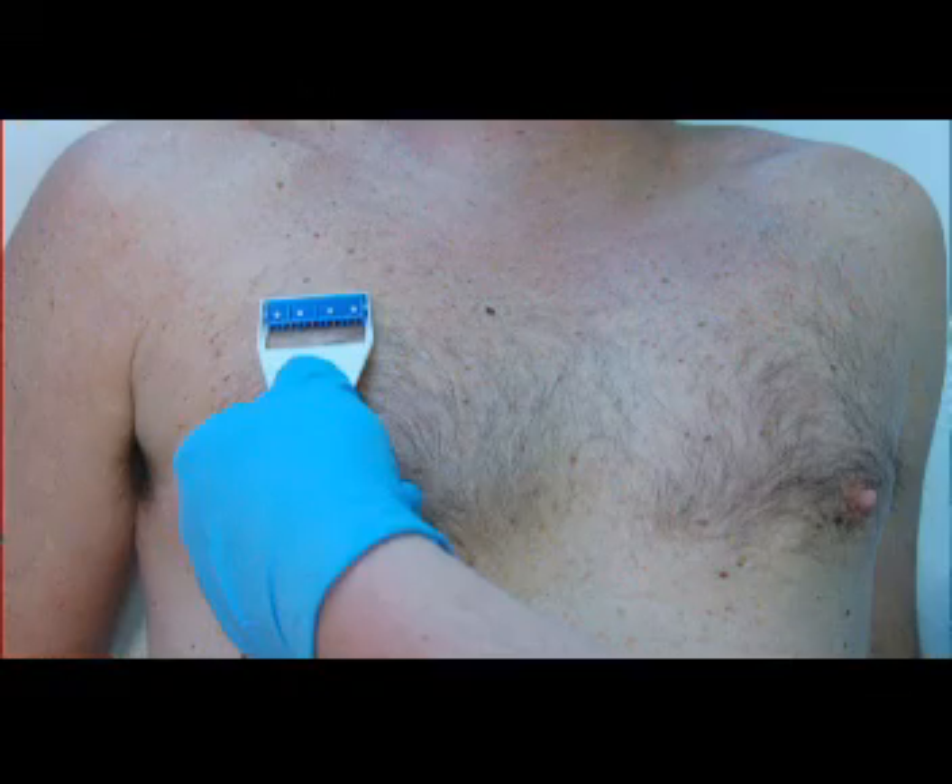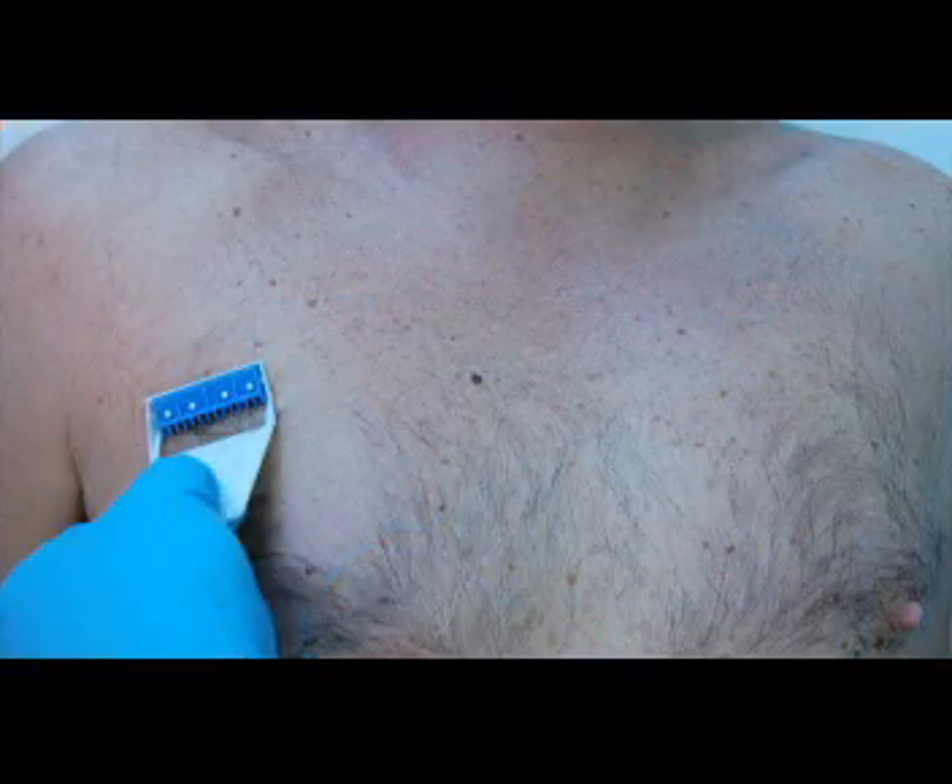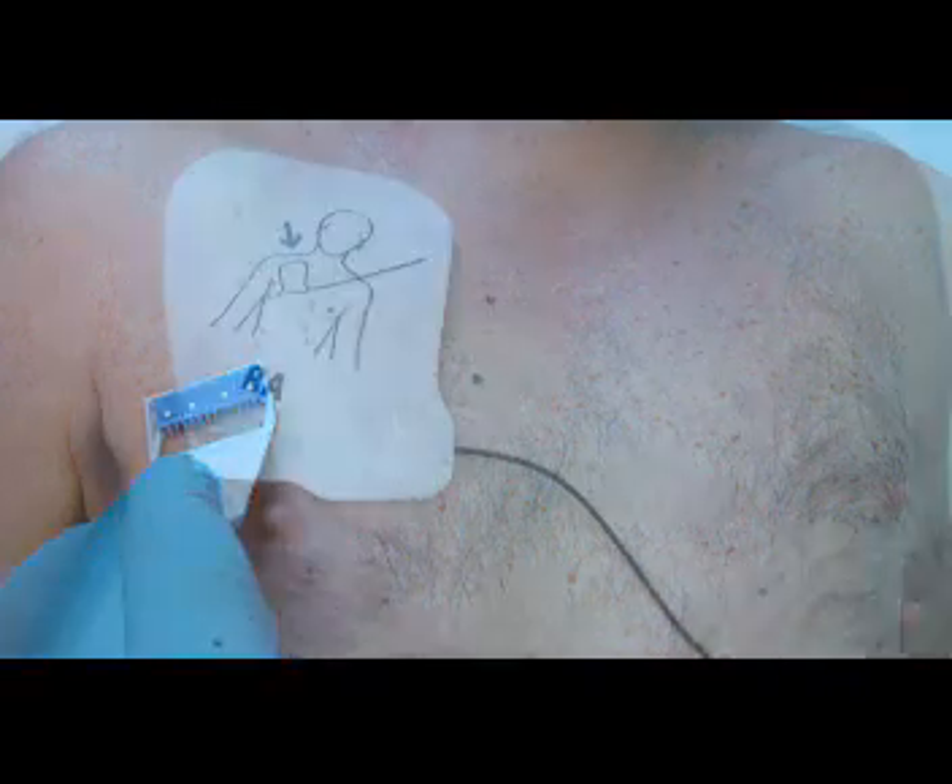Chest hair can limit contact between the electrode and the skin, making it difficult for the AED to analyze cardiac rhythm and deliver a shock. When a patient has a hairy chest, quickly shave the area before applying the pads. If the pads have already been placed and the AED can't analyze the rhythm, press the pads firmly to the skin. If that doesn't fix the problem, remove the pads with a quick motion to remove chest hair, then apply a new set of pads.